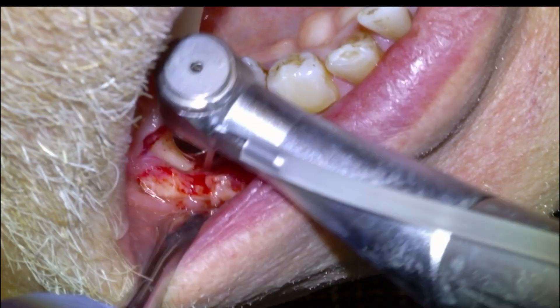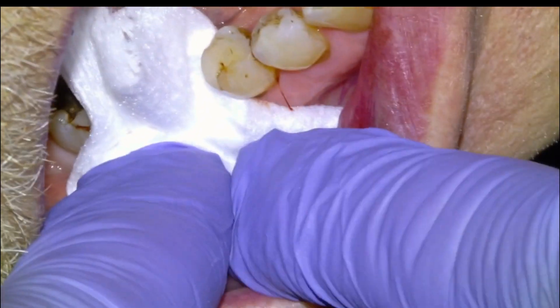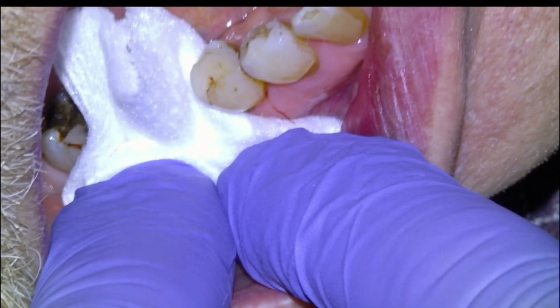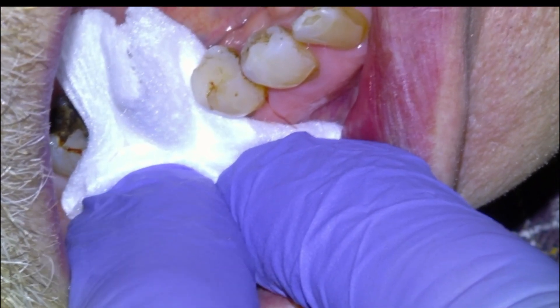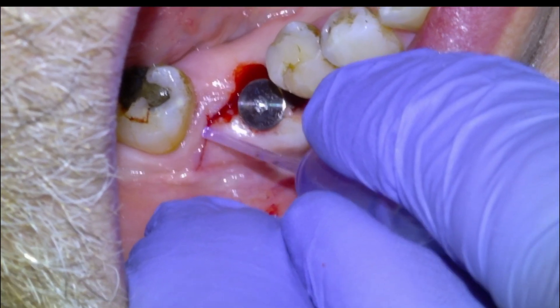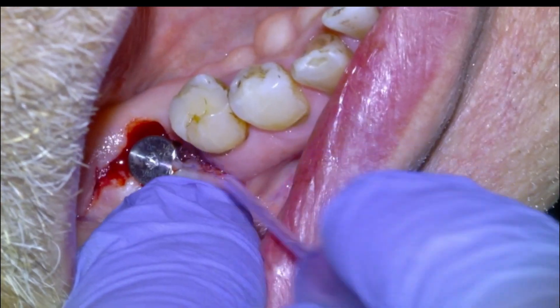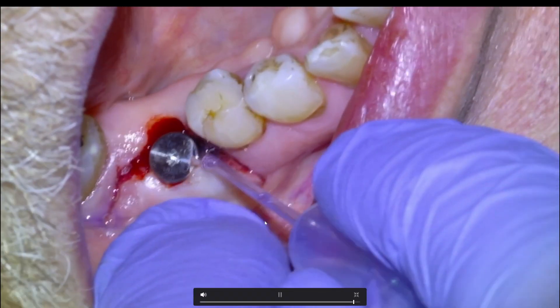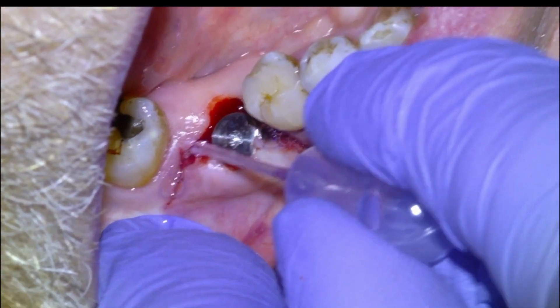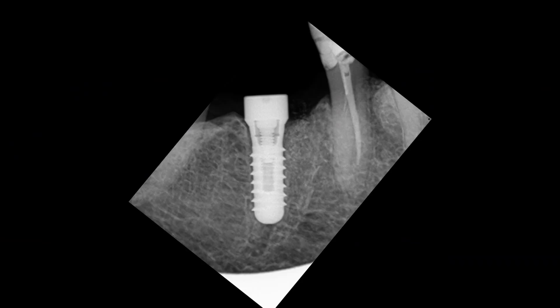Then we'll close up. You have the option of suturing or using a tissue adhesive. One more rinse here. If it's a small enough site, I'll typically just use a tissue adhesive. I'll apply some manual pressure for about a minute to control the bleeding, because the adhesive likes a nice dry site. Then we'll apply the adhesive — this is a product called Glue Stitch Fast Set Periacryl — and it works great for little stuff. That's pretty much it. We'll give post-op instructions: 1000mg of Tylenol, 600mg of Advil, and 2g of amoxicillin preoperatively, and then a rinse with hydrogen peroxide. We'll send them home with a bottle of chlorhexidine or hydrogen peroxide and have them back in two or three months to put the crown on.